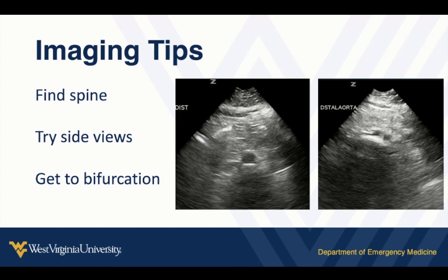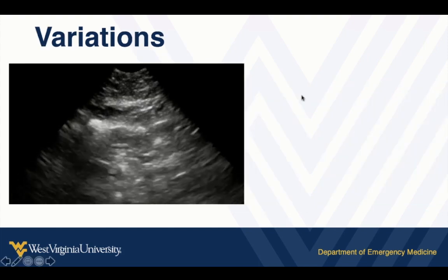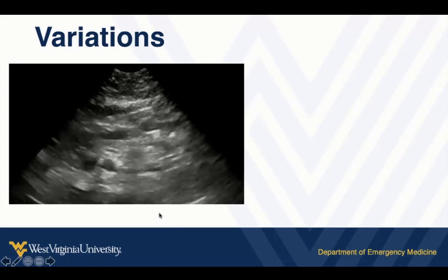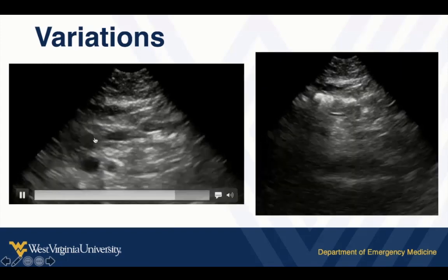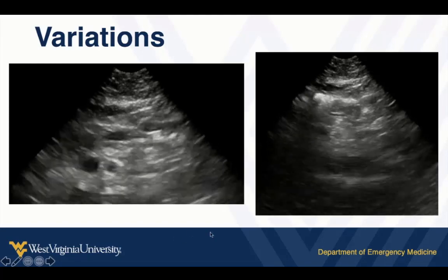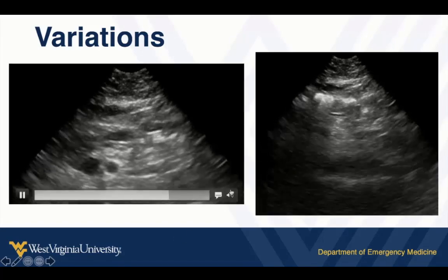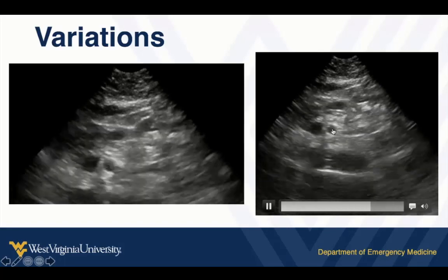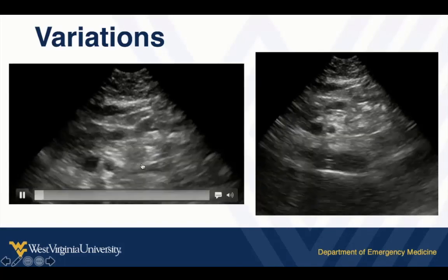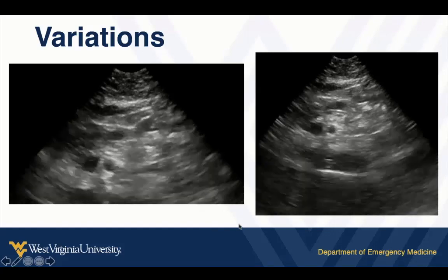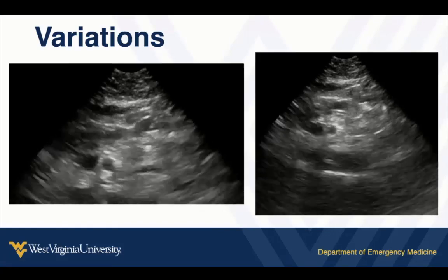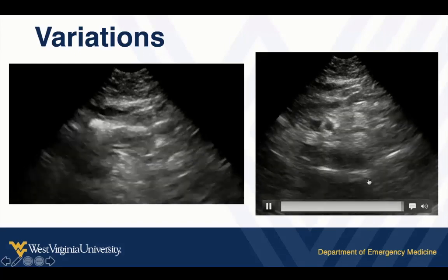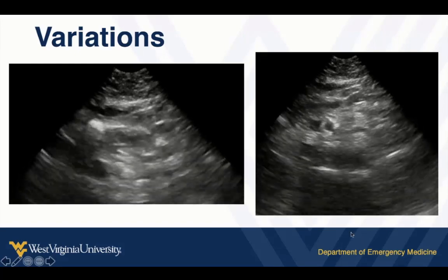One common mistake is you see a vessel that looks small and normal, but you've made the mistake of not giving adequate depth and not identifying the spine. On the same patient, when we increase our depth we see the spine is actually further back. What looked like the aorta was actually the superior mesenteric artery sitting more superficially — sometimes mistaken for the aorta because we looked too superficially. Make sure you're deep enough: see the spine with its shadow first, then identify your aorta from there.